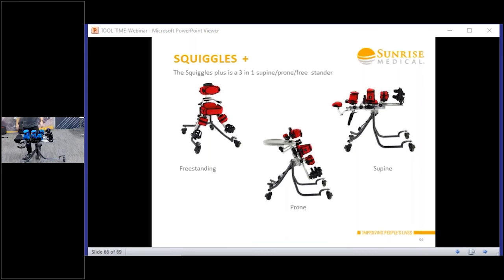And then the only thing different, if you're setting it into the prone, all you're doing is taking the headrest off, and then you're rotating the actual foot sandals. So really simple. We can do it as quick as we need to. Then you loosen it. And that's just another hand wheel, right? Just fix the sandals. Yep.